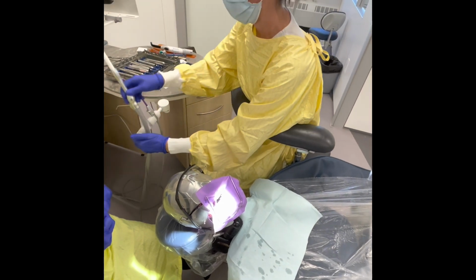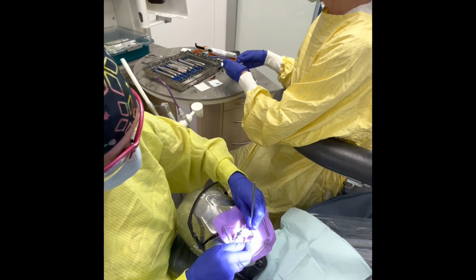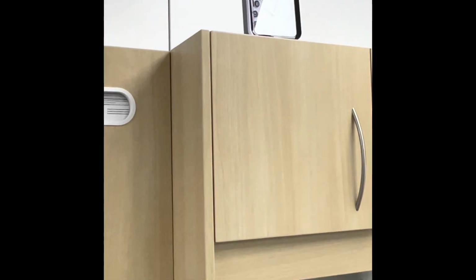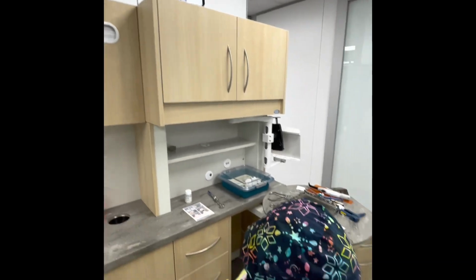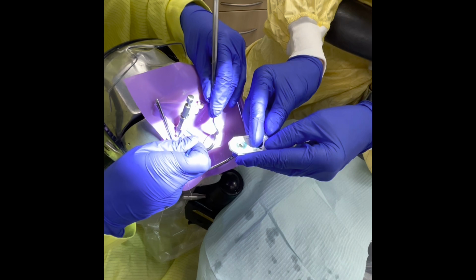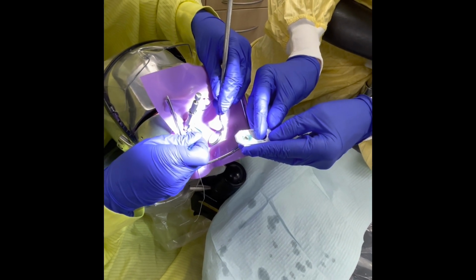So Stacy has rinsed and dried. All right, so can I watch the clock for 20 seconds, Amanda? Yes, please. Thank you. So she passed me the brush there. Your operator may come back and dip in here. That is fine. Most do. And they're going to agitate for the 20 seconds. As you can see, Stacy is watching her clock.